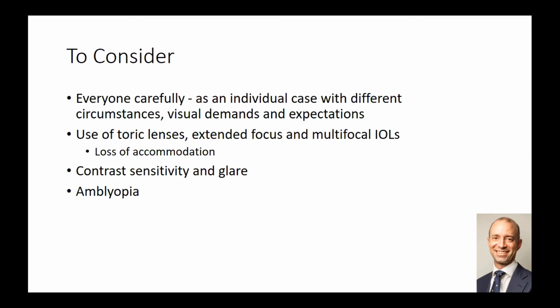We have other refractive options, and more, in cataract surgery in children and in adults, we have to think of those refractive components too. The use of a toric lens, and then it's really food for thought for another discussion, but using potentially in the future extended focus or multifocal intraocular lenses in children. The loss of accommodation is a very significant part of the discussion, in particular in informed consent in an adolescent patient.